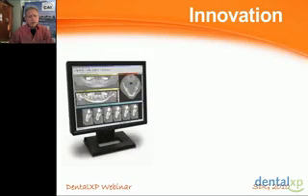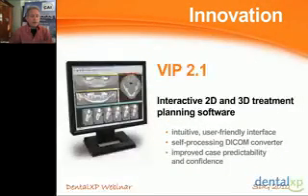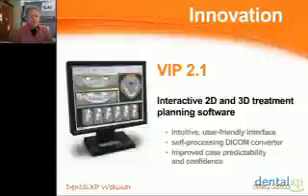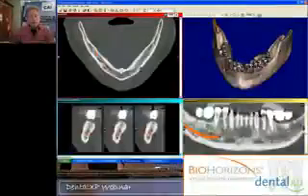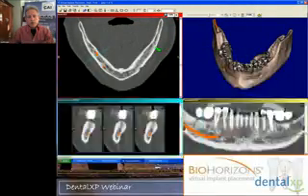And so there are a whole bunch of new tools, new software. BioHorizons specifically utilizes their VIP software, which is based on Implant Logic Systems by my good friend Dr. Michael Klein, allowing for interactive 2D and 3D treatment planning software and the creation of surgical guides, surgical templates. So there are various software applications out there, but what's really important is that we understand the 4 major views.